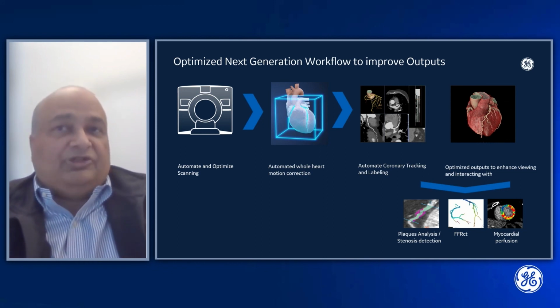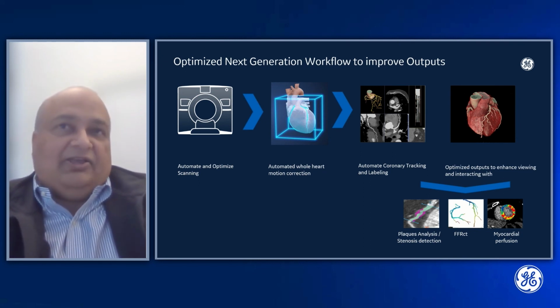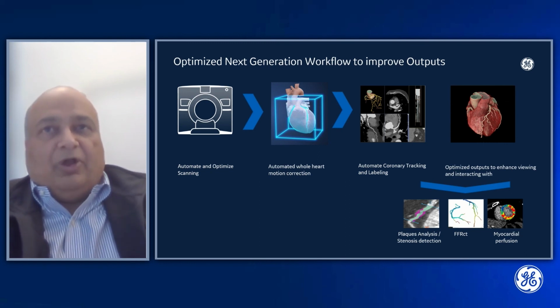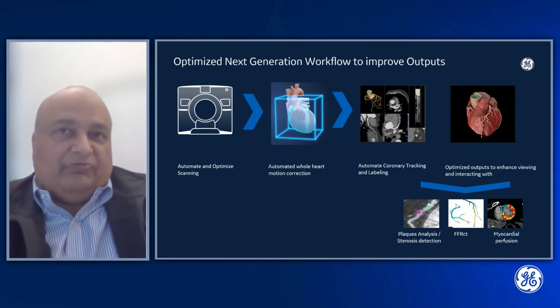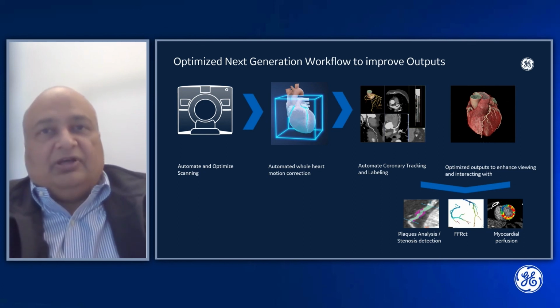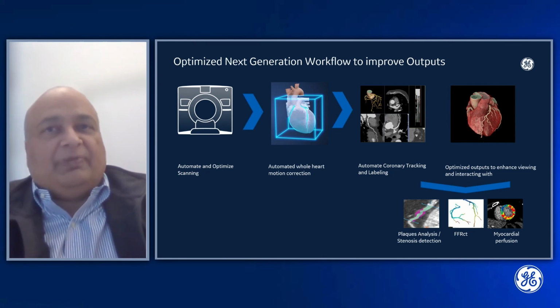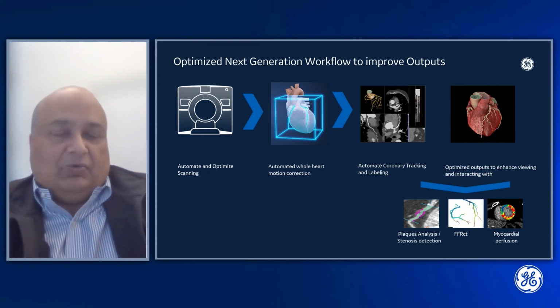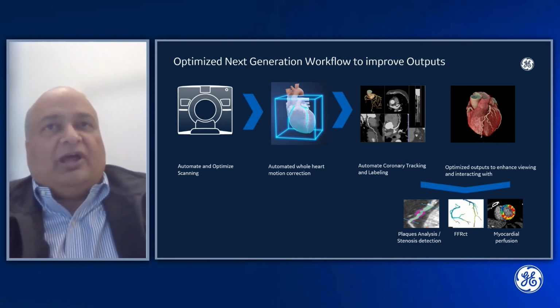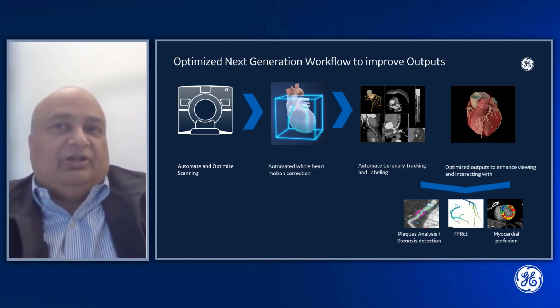If there is a finding in the future, we can go into what we need to do with that particular finding. If a finding is a constriction or a blockage in the coronaries, what are its downfield effects? So we're working on technologies that can help assess that, like fractional flow reserve components. In addition to that, if there is a finding of a plaque, what is that plaque analysis? What's the composition of the plaques? We've got tools in place that can work on that. In addition, we also have the ability to do dynamic acquisitions, as I mentioned before, and really look at the myocardial perfusion using blood flow analysis at the myocardial level.